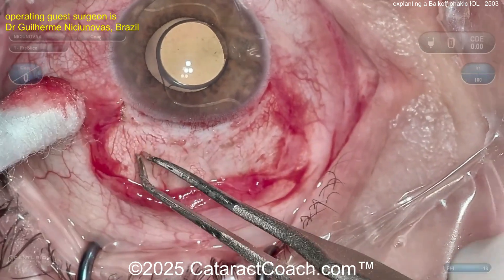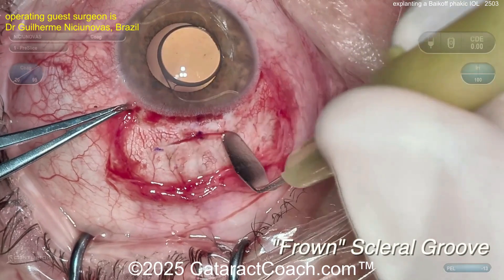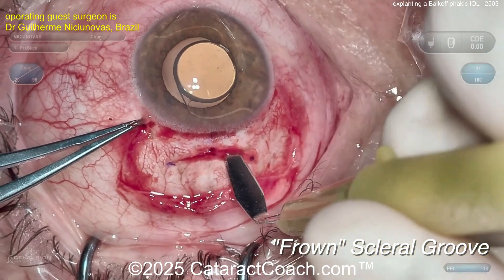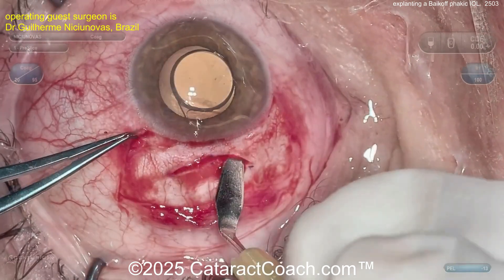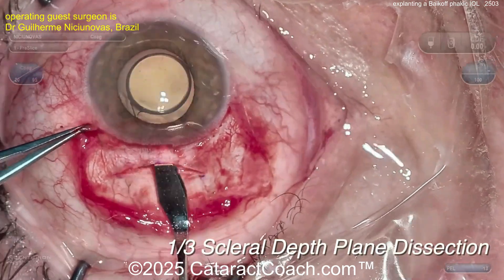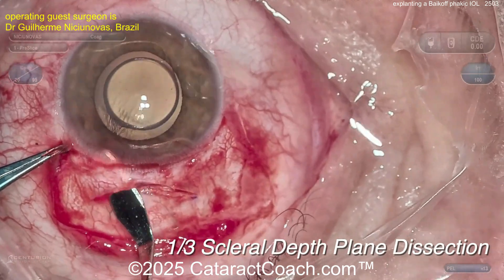You know the trick for an MSICS incision — you've got to have it trapezoidal shaped. And a long tunnel length. Remember, the 'S' means shelved — a shelved incision. There's a frown, which gives you even better sealing and makes it a little more astigmatically neutral. Using this crescent-type blade to dissect, dissect, dissect. Look — you're still not in the anterior chamber. That's splitting the cornea here, so it's a long tunnel length incision.